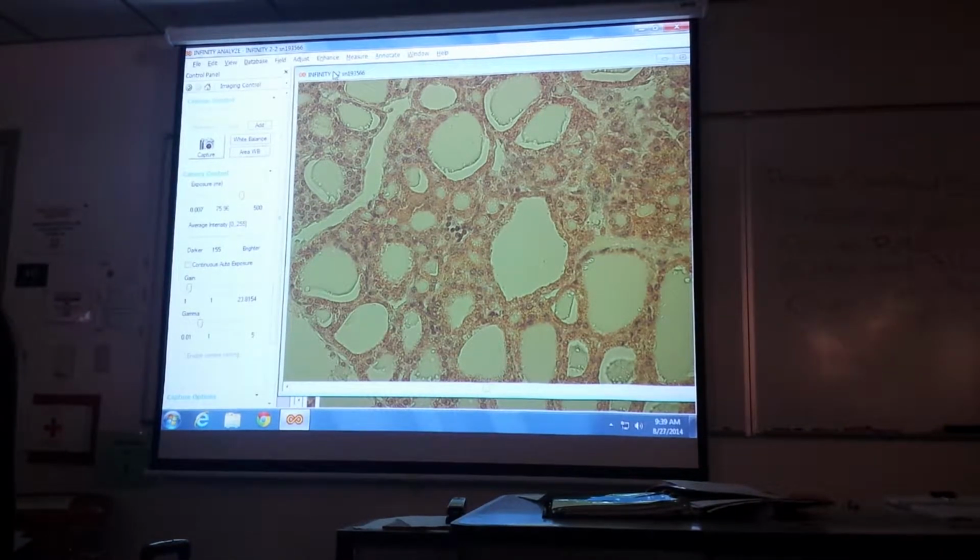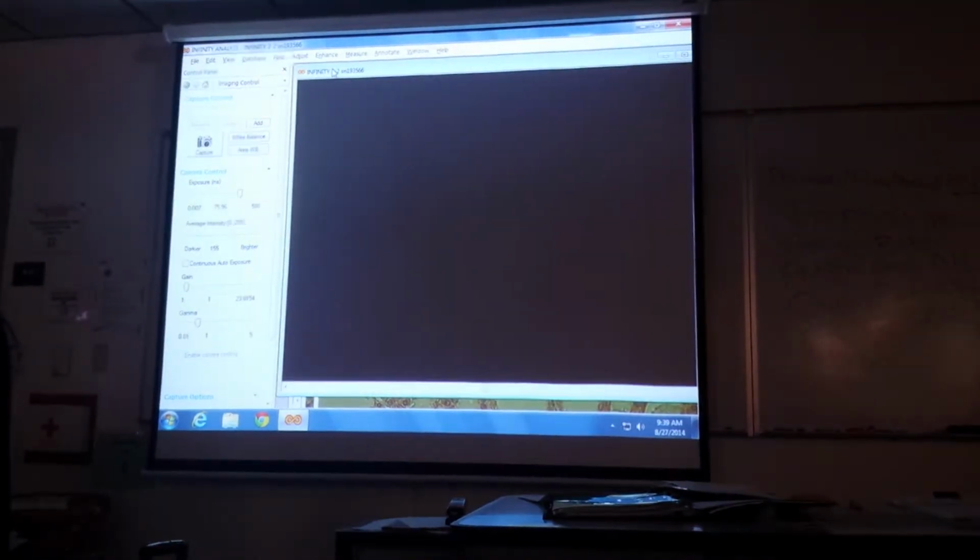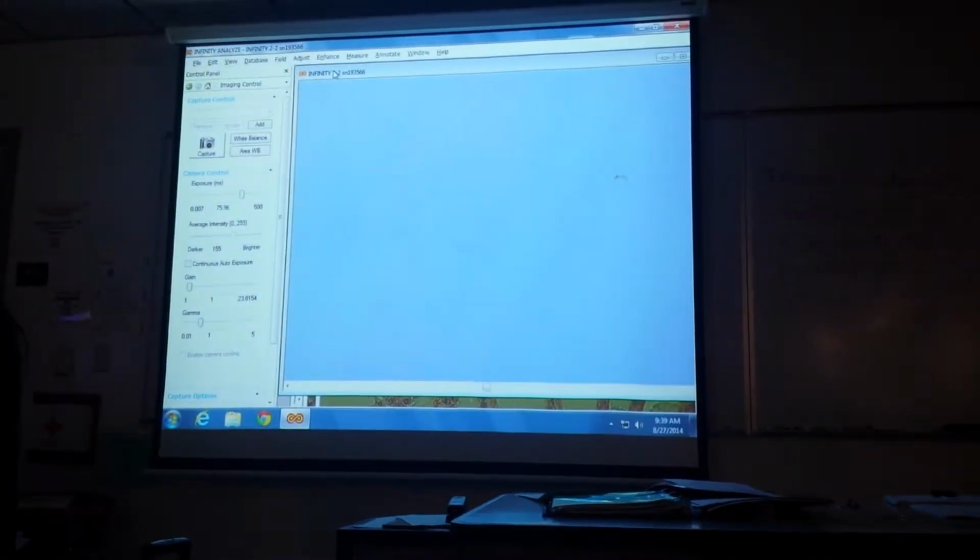I'm taking pictures for you. So technically, this is your lab time. I'm basically doing a lot for you, saving a lot of time. Thank you.